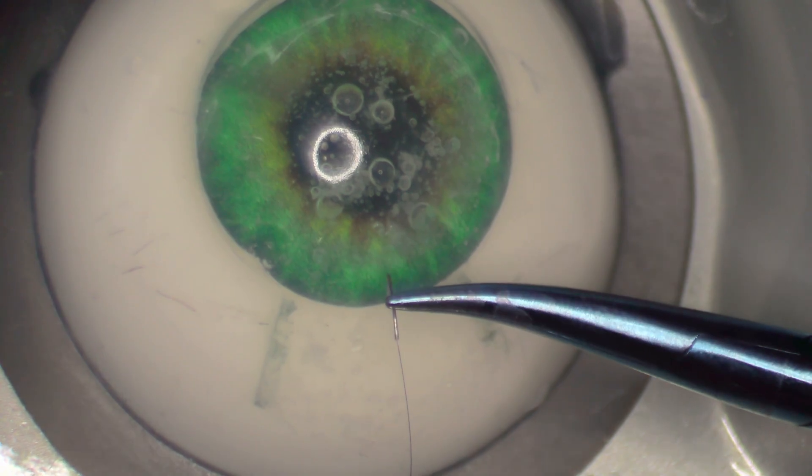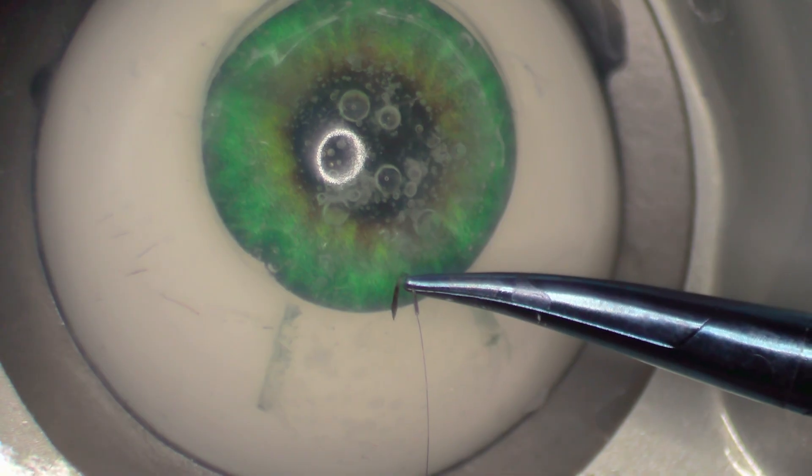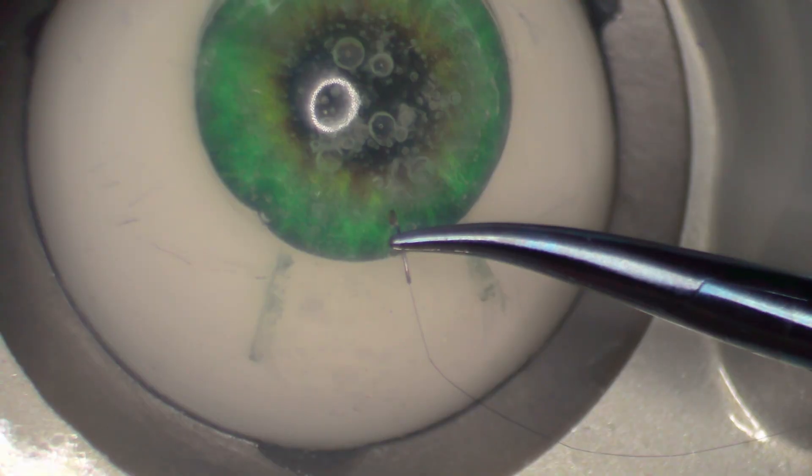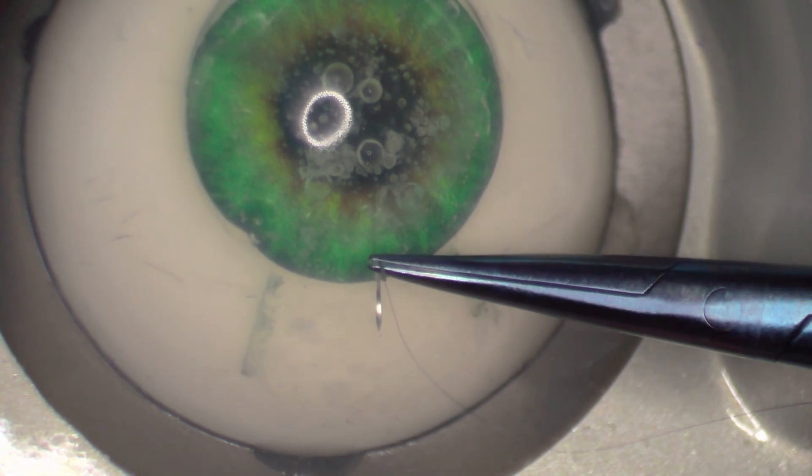Step three: puncture the cornea. Make sure you're pointing the needle down towards the optic nerve. Don't hold the needle parallel like this. You want to go through the anterior and posterior lip of the wound — you don't want to stay superficial. Step four: follow the curvature of the needle to puncture the cornea, sclera, and conjunctiva.